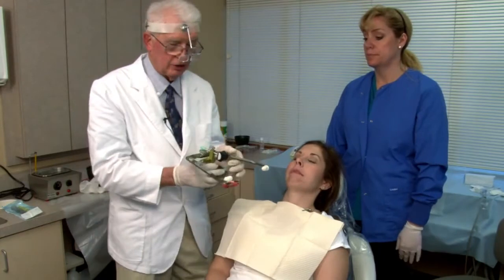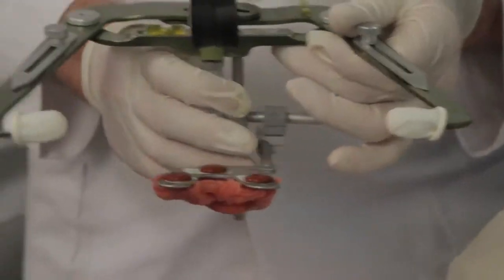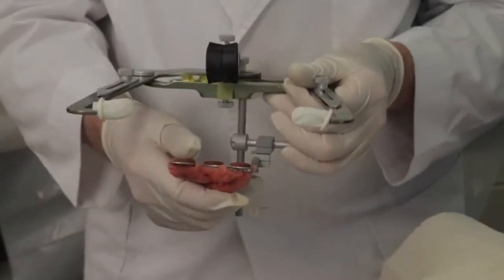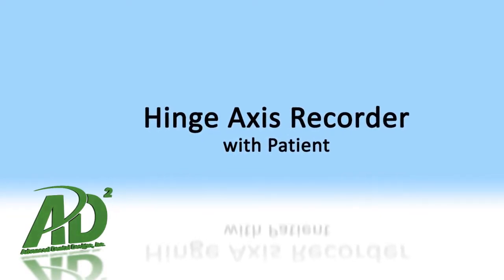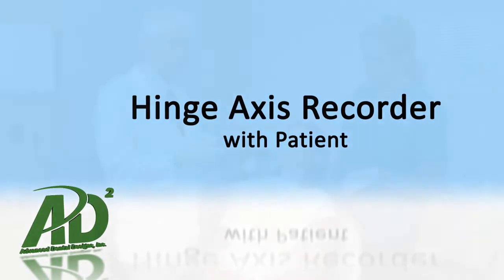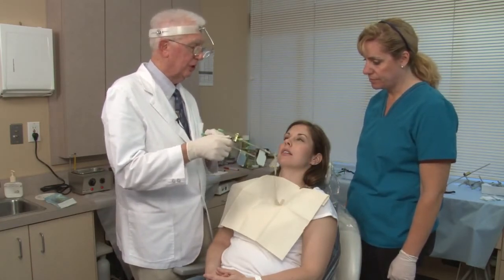Now the next thing that I do is I take a look. I first check my bite fork. Did I keep it good and tight? Appears to be tight. I'm not putting a lot of pressure on, but I do put some pressure. I want to get as much as I can adjusted for the patient before I actually put the clutch on, because once the clutch goes into the mouth, I want to move forward as fast as I can for the comfort of the patient.